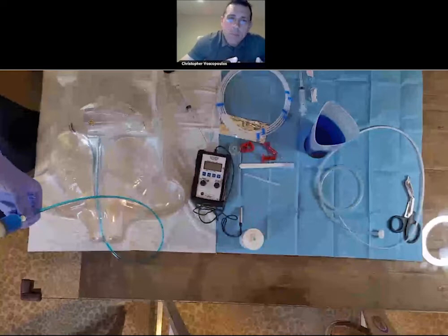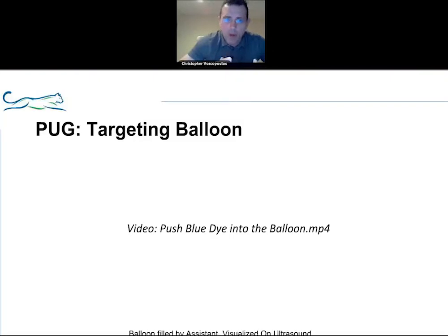Now there are two unique aspects about this part that I wanted to comment on in reference to this ultrasound-guided approach. The first is that we had the magnet here at the upper left quadrant of the patient, and that magnet helps to bring the orogastric balloon up into that area. That provides an ideal tract for placement of the gastrostomy. Ideal in reference to if you wanted to convert a G to a J tube, you have your tract already facing the pylorus. That's a big advantage of being able to manipulate that magnet into that region.